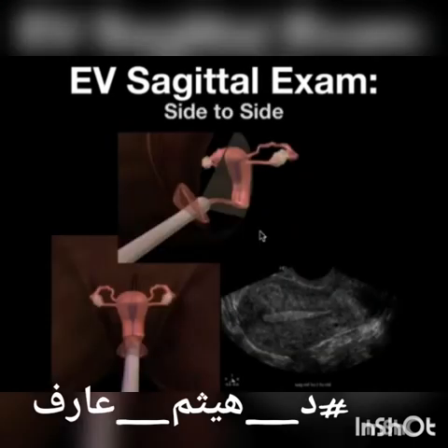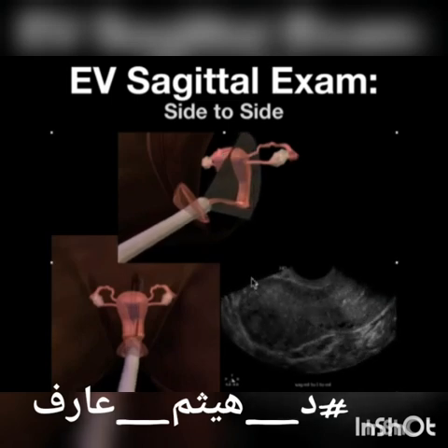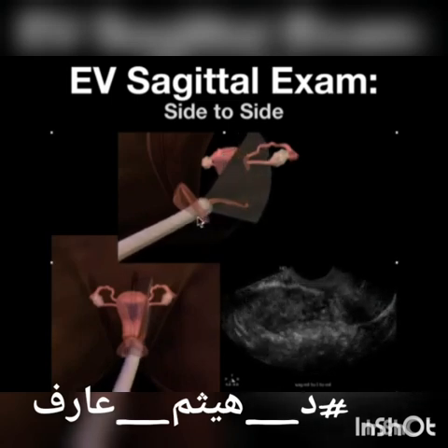Remember, scan the whole uterus. So here we've got an anteverted uterus here. This is caudal, cephalad, anterior, posterior. Here you've got myometrium. Here you've got endometrium. Here's the posterior cul-de-sac here. What you're going to do is you're going to take the transducer and you're going to sweep from side to side.